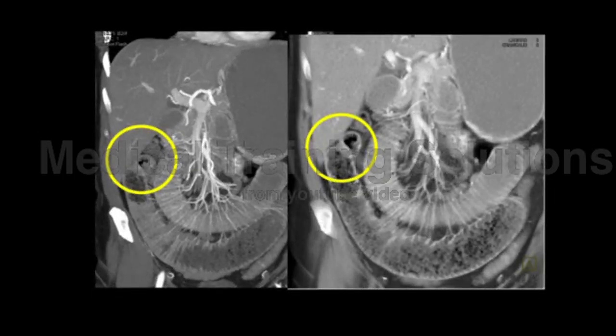Right at the circle. You see that thickening right there? There was an area of adhesions and inflammation. This patient had the adhesion taken care of at surgery, and actually at that point the bowel looked nice and pink, and no bowel needed to be resected. A key thing about getting patients to the OR early is you often can save the need for bowel resection. Removing the adhesion at times may be all you need.